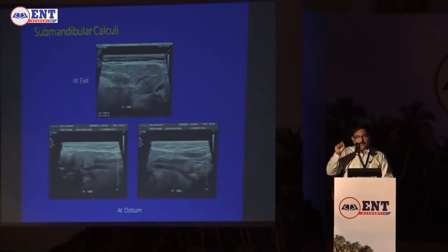If you want to do open surgery intraorally, submandibular stone, if it is large and you can locate it, and you can put a transfixing suture behind the stone to prevent it migrating back, and you have some microscope, it will be very good, you can do it. But parotid, be very careful.